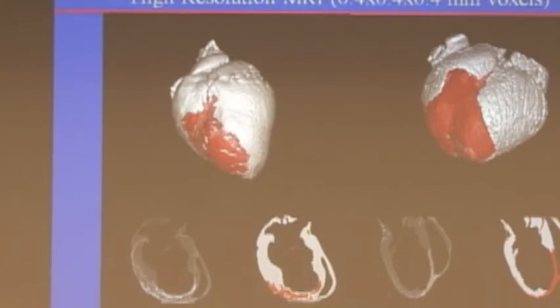And I think what strikes you immediately is that in the inducible animals, you see lots of islands of normal-looking tissue mixed in with the scar. And in fact, it shows up very nicely on the MR section, where you see an amazing amount of tissue heterogeneity. There's scar and normal-looking tissue all mixed together. You see it very nicely on the colorized slices. But in the non-inducible, there's amazingly little of this. There's very little of this normal-looking tissue.